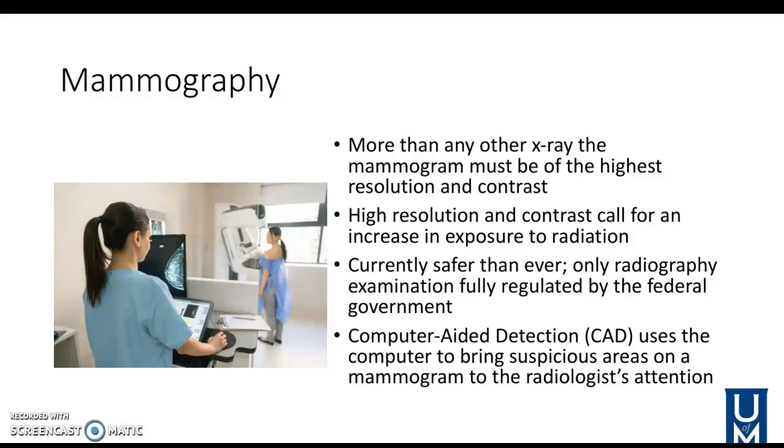And then computer-aided detection, CAD, uses the computer to bring suspicious areas on a mammogram to the radiologist's attention. So this is a great test. It saves a lot of women's lives detecting breast cancer. So I cannot speak highly enough about the bounds and strides they've made in mammography.